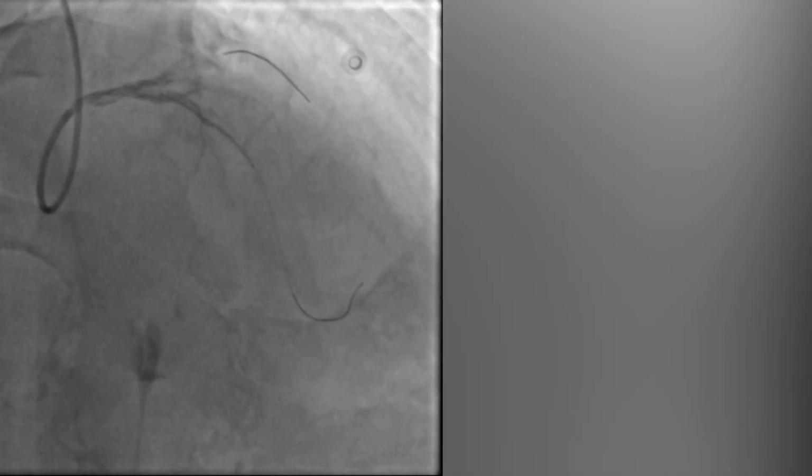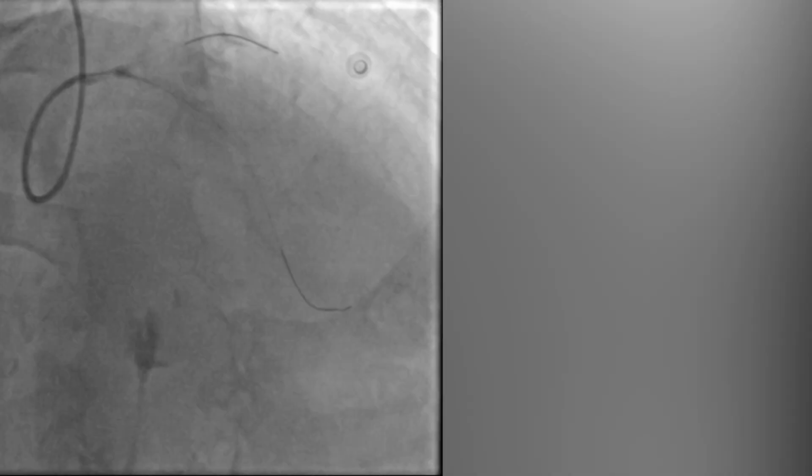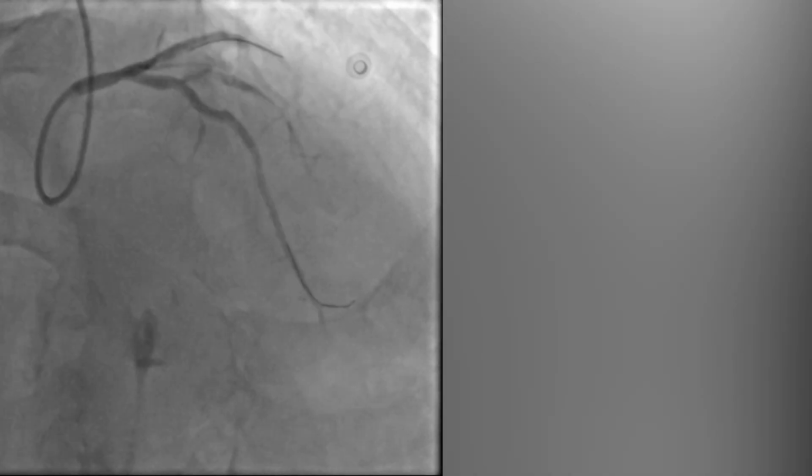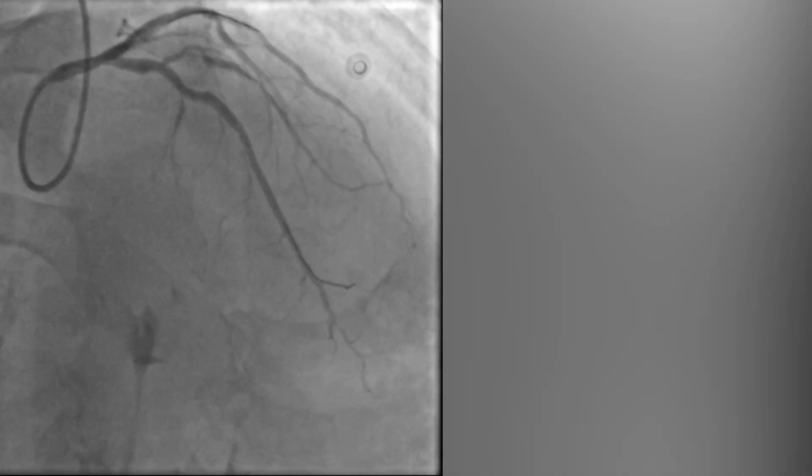Next, a properly sized stent was deployed across the lesion and inflated. In a post-deployment contrast injection, the vessel demonstrates excellent luminal expansion. To ensure optimal stent apposition to the vessel wall, post-dilation was performed, following the standard technique previously discussed in the earlier videos.